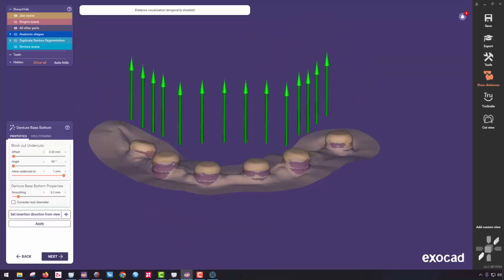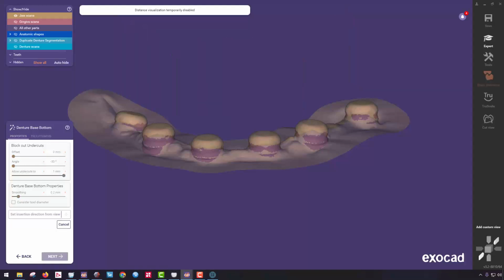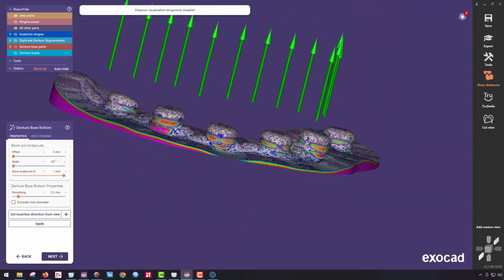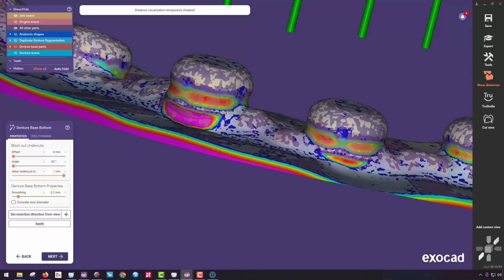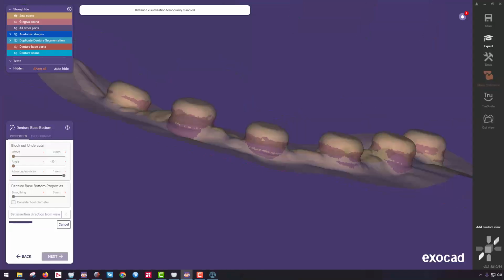Now it's going to ask for the undercut. Now, since I have scan body geometry in here, I typically don't want to have any offset. So I hit 0 for this offset button, and then I click the apply button. And I don't want to have any of this blocked out because I've already spent the time and energy to block it out in my other software. So I can make sure that the offset's set to 0, undercuts right in here, and get rid of the smoothing. Let me do that one more time. I don't want to change the intaglio of this at all.